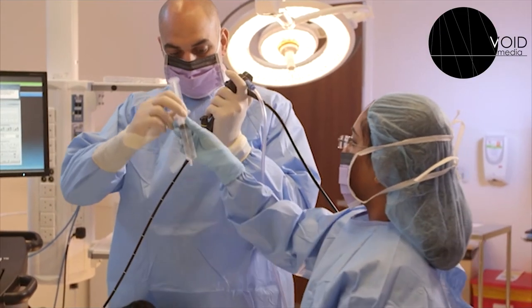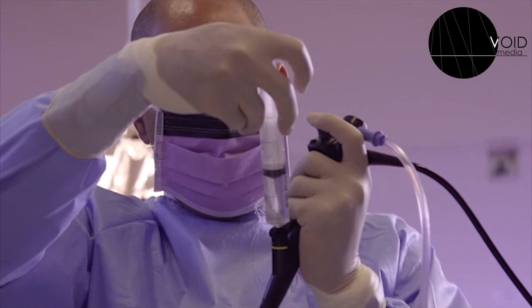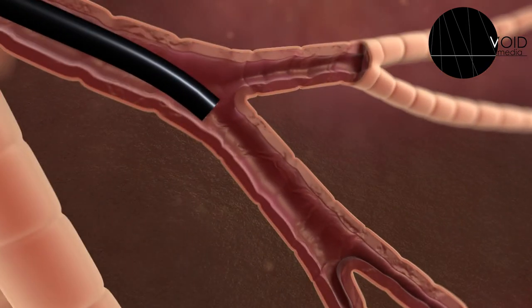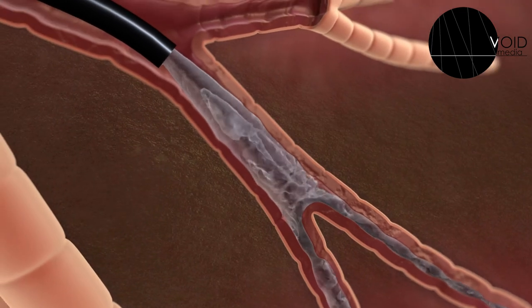If we suspect infection, we might want to do something called the lavage. We will wedge the bronchoscope at the opening of the airway that leads to the part of the lung that we're most interested in. We will then inject salt water into that area of the lung and suction it back out into a container.